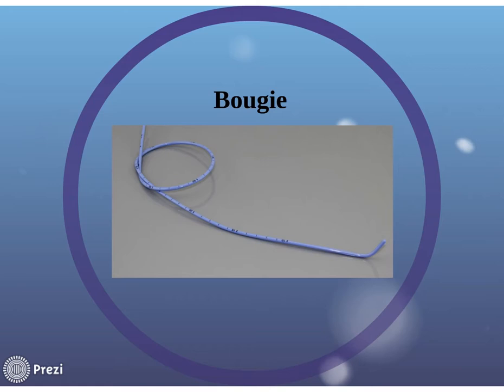It also has another name, the guy that invented this. Remember? Anybody know? Eshman stylet. It's also called that. So if you're in a clinical setting, they say, grab the Eshman stylet, and you go, all I see is a bougie. I'm saving you a moment here. You're not going to lose any points because you know it has more than one name. So I call it the bougie, or some people say, let the bougie down. Not really. It's also called Eshman stylet.